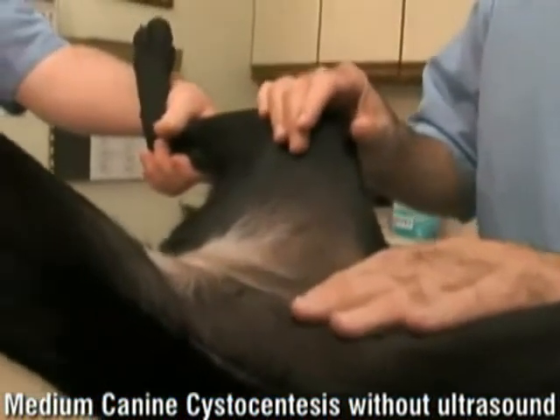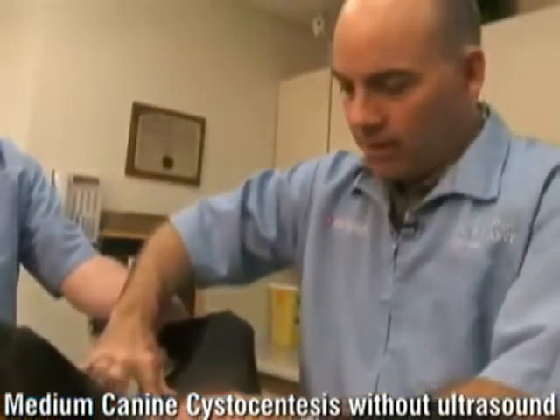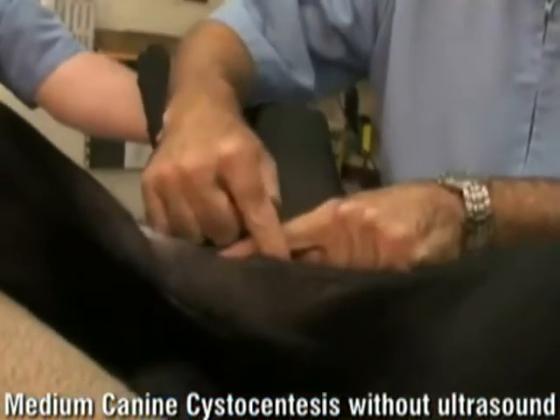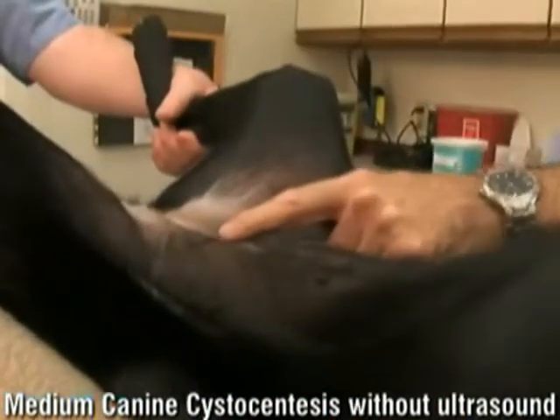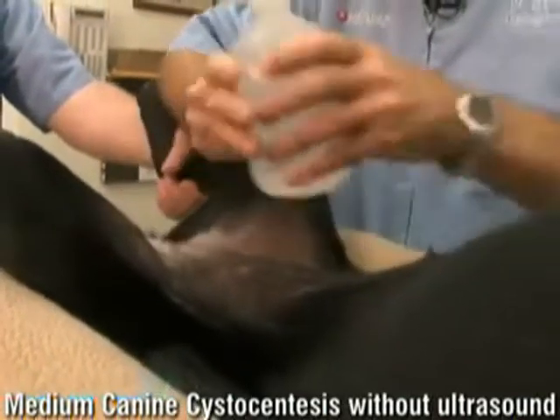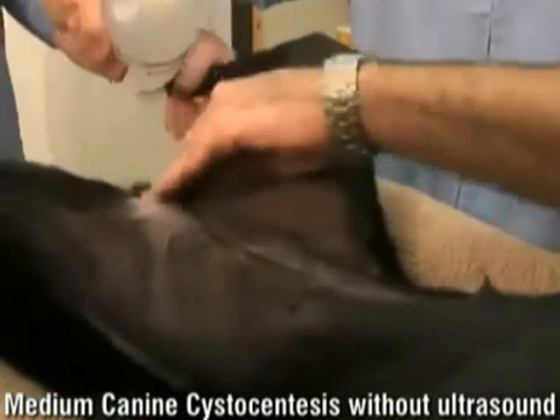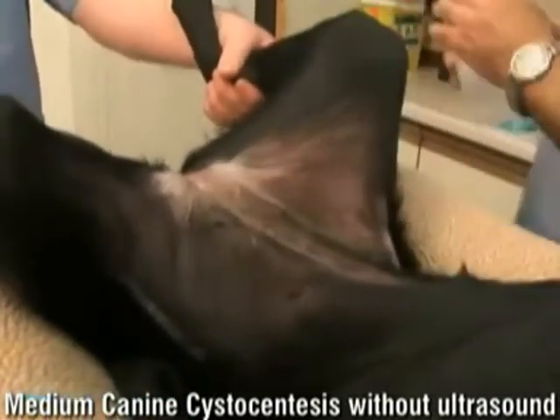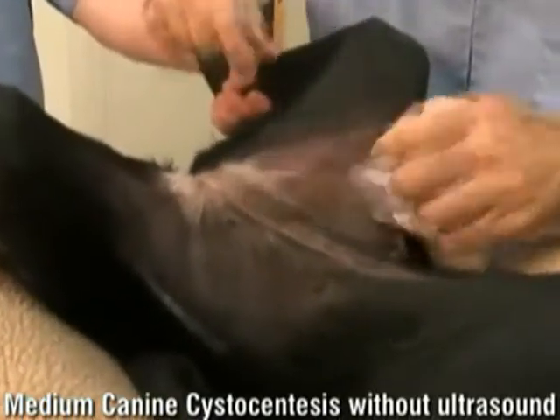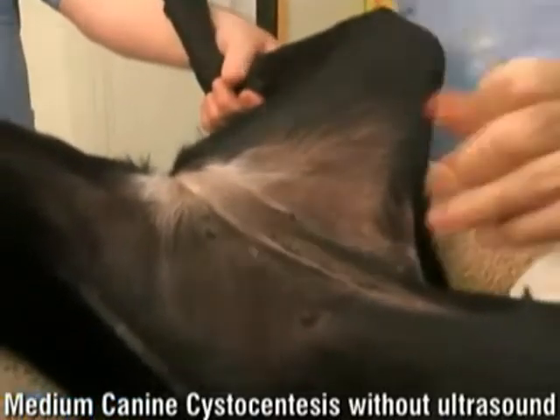We're going to put her head up to the left, Dr. Griffin, and just kind of drop her right in here. Most dogs, once they get on the couch, will relax — it's not uncommon for some of them to fall asleep after a few minutes. You can see she's vicious. If we're going to collect urine by laying them on their back, this really only works for females. We can palpate where the pelvis is right about here — you can feel the pubis right here. So that bladder should be in here if it's reasonably full.